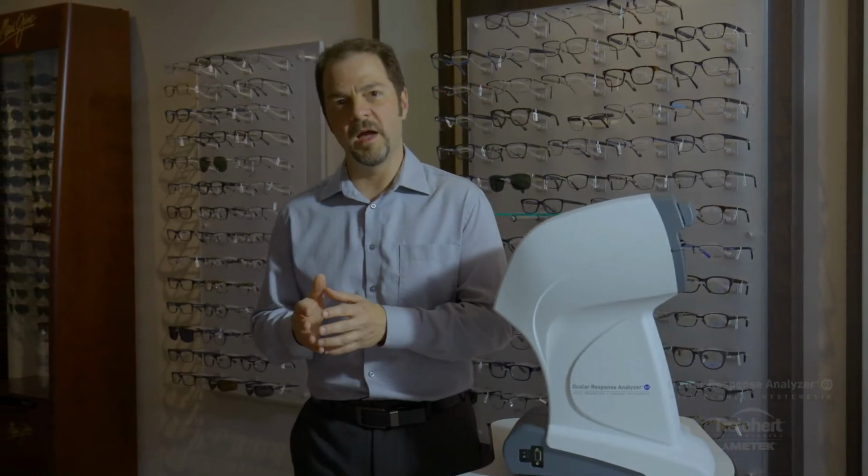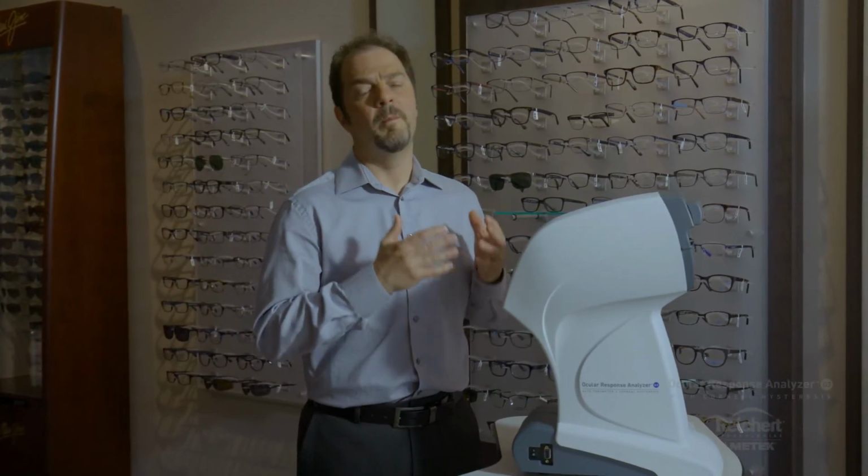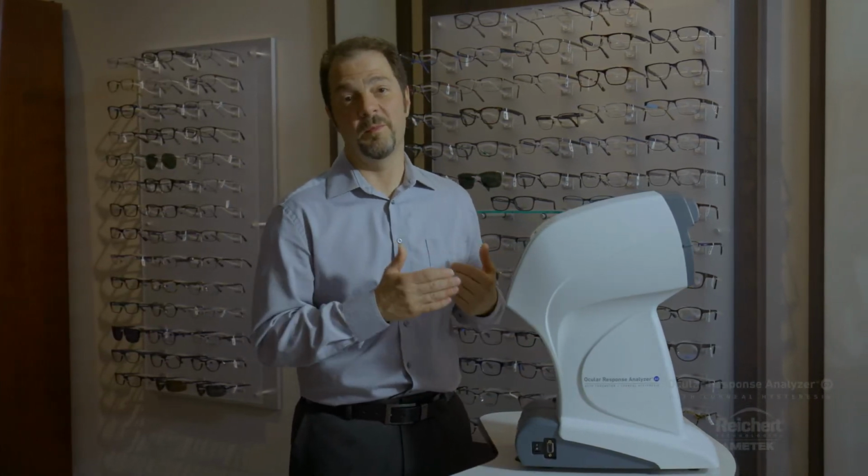Could be related to the ocular pulse, or it could actually be a pressure difference between the two eyes. Look for good waveform scores, and if you see an asymmetry that's concerning to you, make multiple measurements to try to average out those pressure fluctuations. If you wind up with a 4 millimeter difference between the pressure in the two eyes, that's what it is.